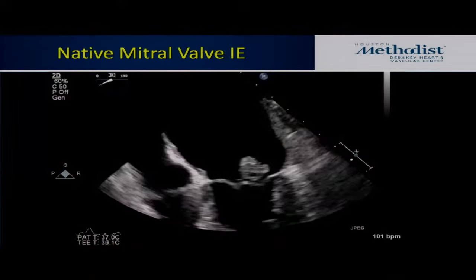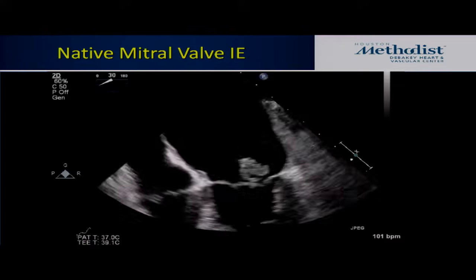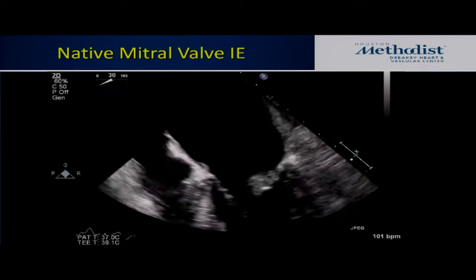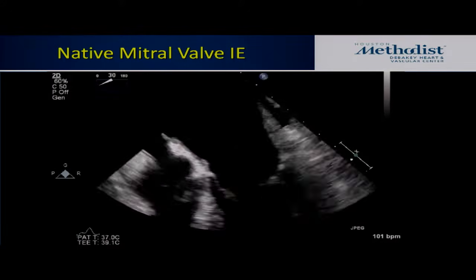Okay, so first question in a discussion of endocarditis is the prototypic lesion, which is a vegetation, and what does that really mean? What is a veggie? To answer that, we'll talk about both its imaging characteristics and then some of the histology and the pathologic characteristics. So this image here, and I'm just thankful it plays, demonstrates most of the hallmark features of a vegetation.